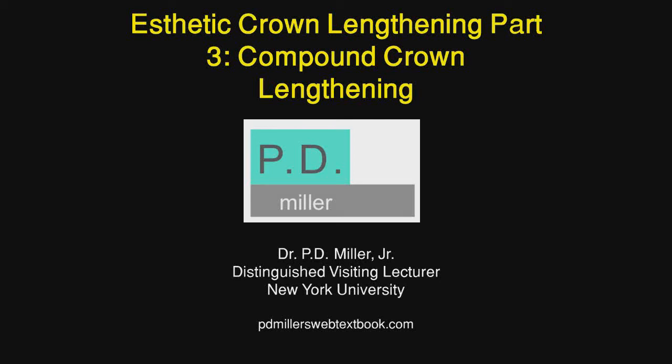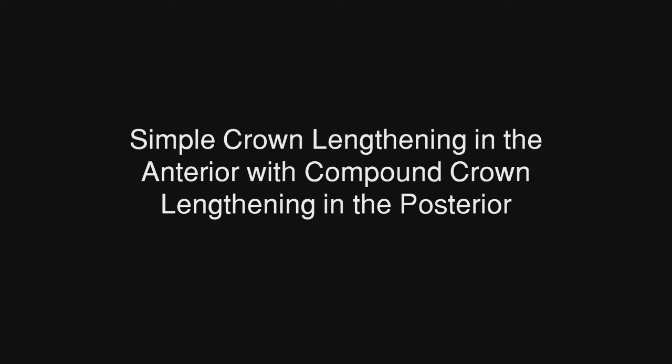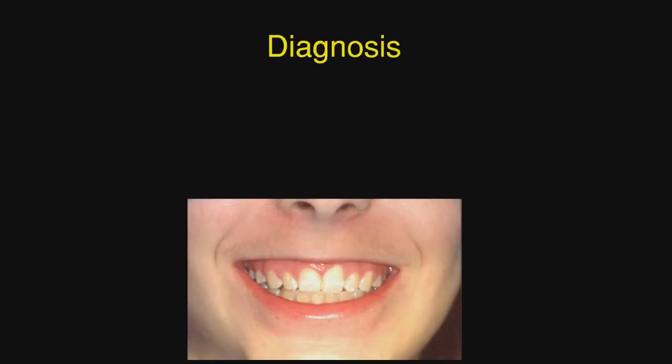Aesthetic crown lengthening, part 3, compound crown lengthening. Compound crown lengthening is removal of facial gingiva and buccal bone. And you will remember from the second video where we talked about simple crown lengthening, which was just removal of facial gingiva, unattached gingiva. The first case we're going to show is simple crown lengthening in the maxillary anterior with compound crown lengthening in the posterior.